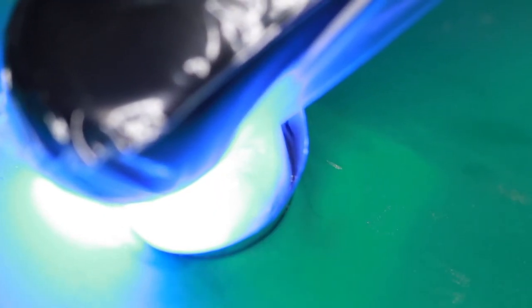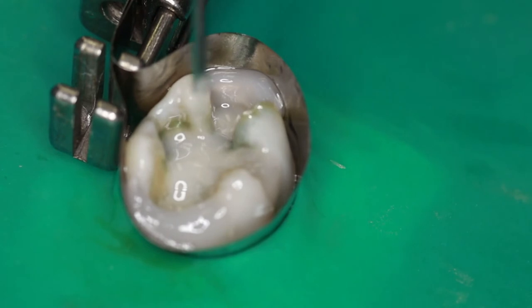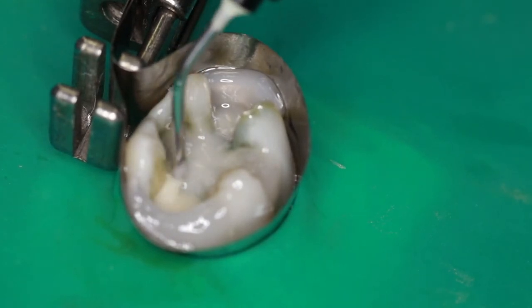You are probably thinking — okay, that is all mildly interesting, but why wouldn't you just bond in a filling instead of using a dental pin? Well, there was a point in time that dental bonding wasn't very mainstream, and the filling material of choice for back teeth was silver amalgam. Silver amalgam fillings don't stick to tooth structure — they are held in place by undercuts, where the cavity prep is shaped so that the hole on the surface is smaller than the rest of the cavity, so the filling material can't physically fall out. But in certain situations, such as when a cusp breaks off, there may not be enough tooth structure left to hold the filling in.